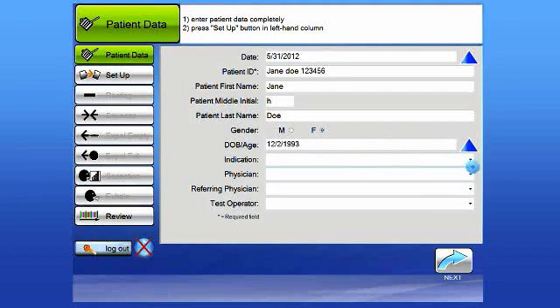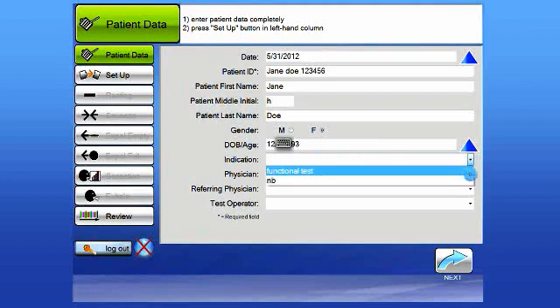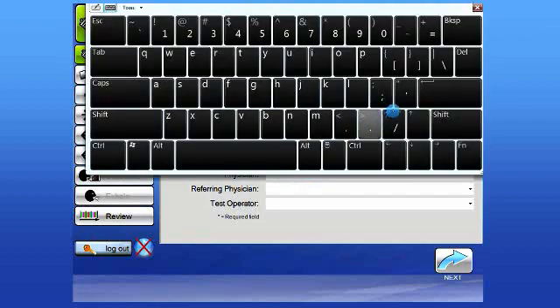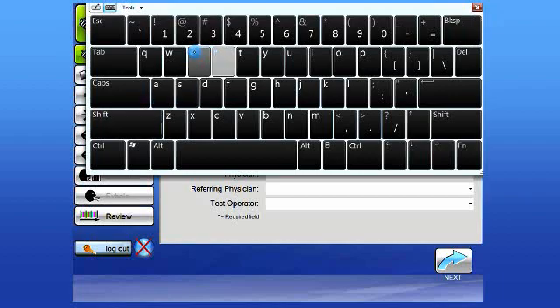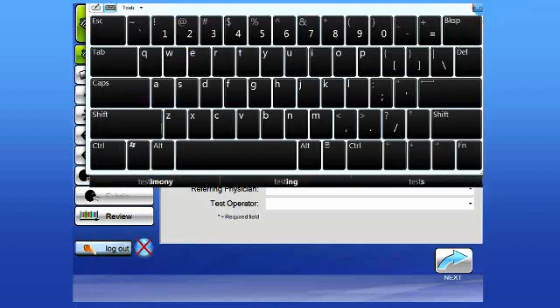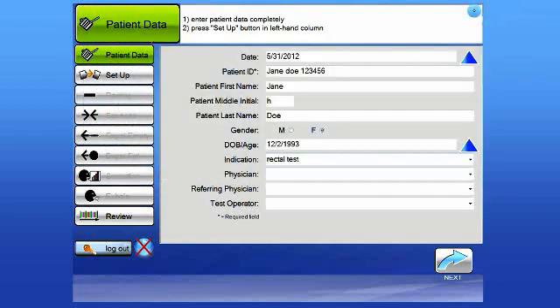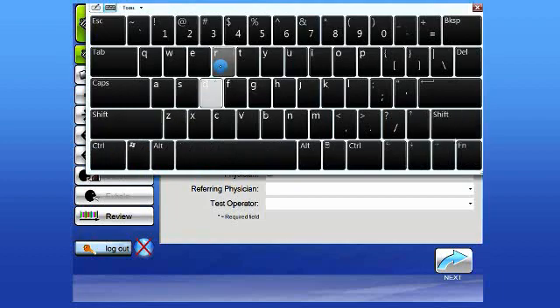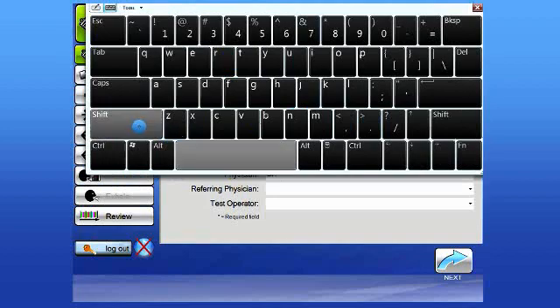The next field is the indication. There is a pull-down menu. If there's already an indication in place, you may simply tap Enter. You may also enter a new indication in that field. Once the information is entered, it will be there in the pull-down menu going forward. The next field is Physician Name. You may use the pull-down menu to choose an existing name or enter a new physician's name.